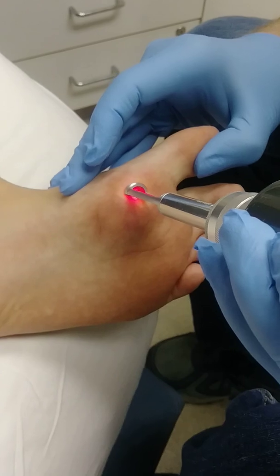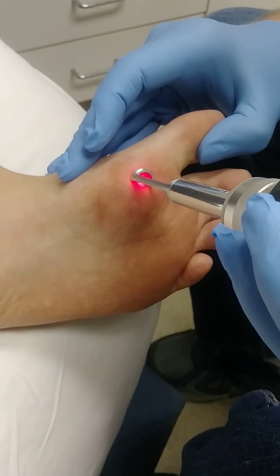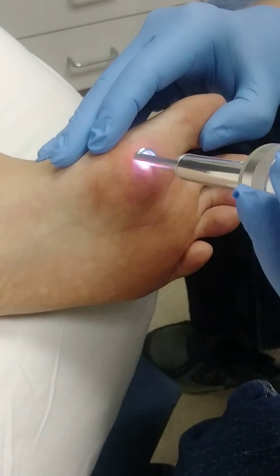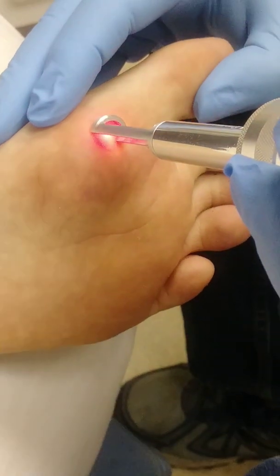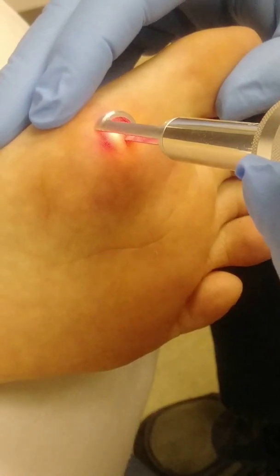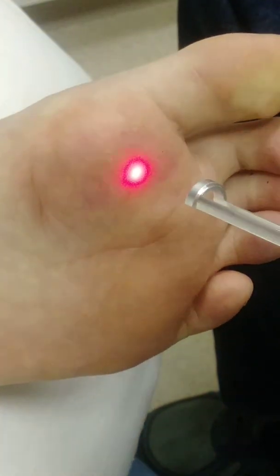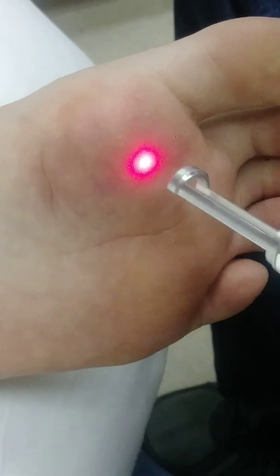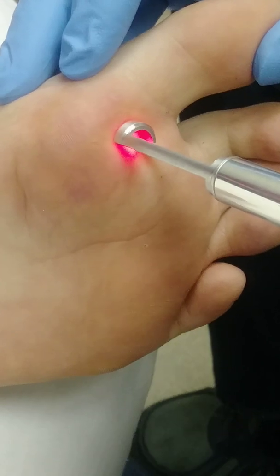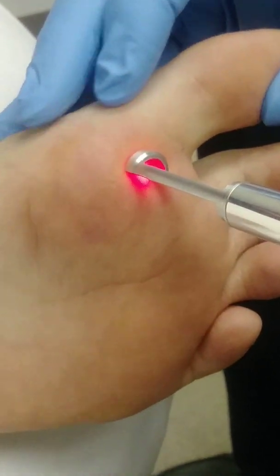You have to wear glasses to do this, which does make it a little more difficult to see. Sometimes when I keep it on one spot for several shots — when you hear that clicking, that's it doing the shots, as we call it. The red light is not the laser. That's just a beam so we can see where we are; the laser itself is not really visible with the naked eye.